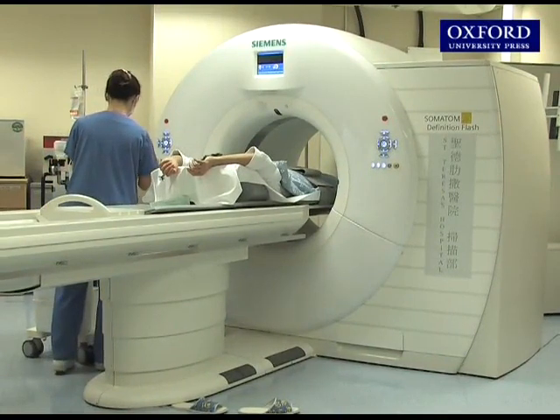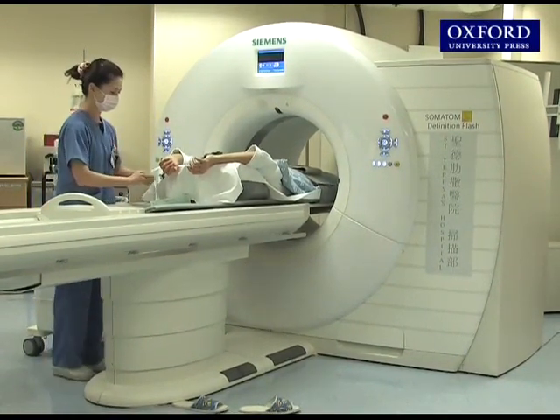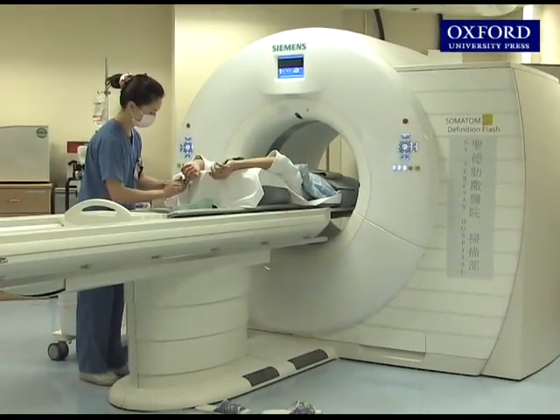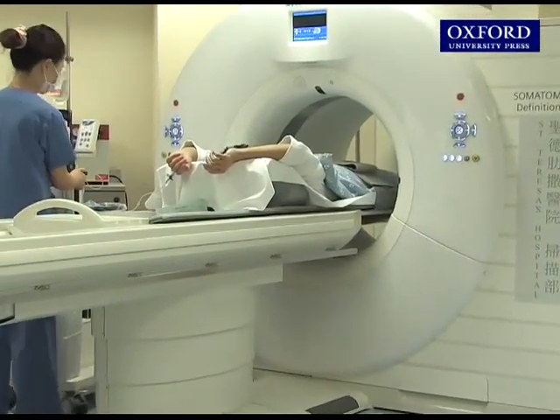The patient will be injected with a contrast medium which highlights the internal organs in the body. A contrast medium injector is now connected to a needle in the patient's vein.